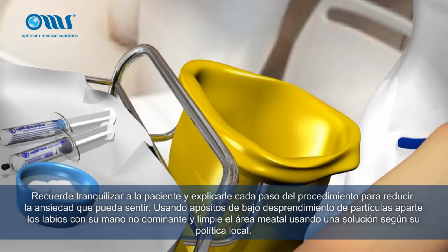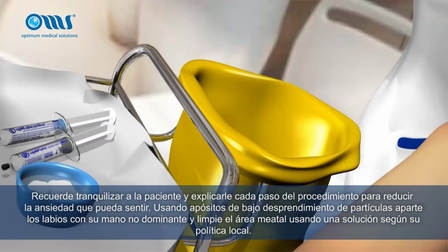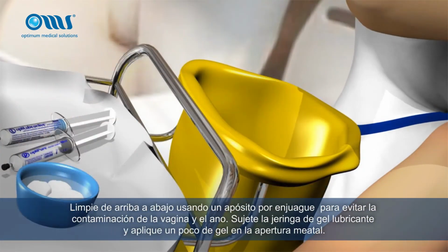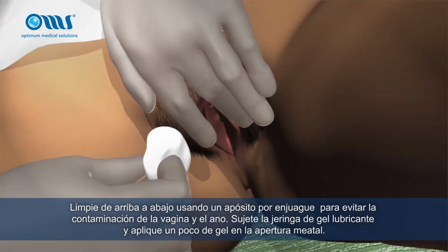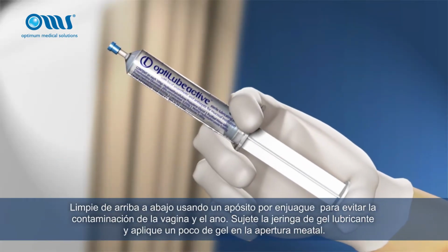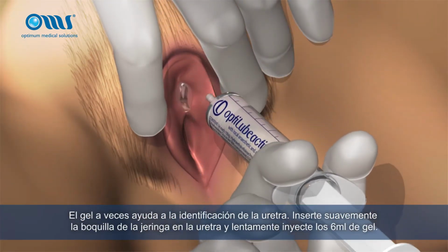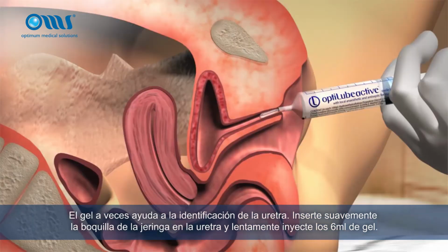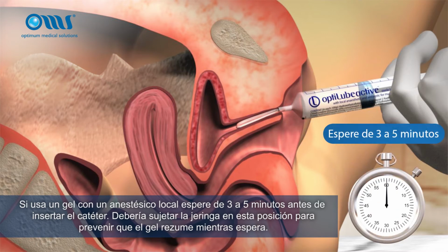Using low linting swabs, part the labia with your non-dominant hand and clean the meatal area using a solution according to your local policy. Wipe from top to bottom, using 1 swab per wipe to avoid contamination from the vagina and anus. Take hold of the syringe of lubricating gel and apply a little gel to the meatal opening. The gel sometimes aids identification of the urethra. Gently insert the nozzle of the syringe into the urethra and slowly instill the 6 ml of gel. If using a gel with local anaesthetic, wait for 3 to 5 minutes before inserting the catheter. You may have to hold the syringe in place to prevent the gel from leaking out while you wait.